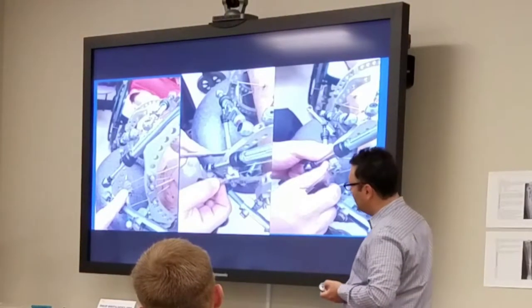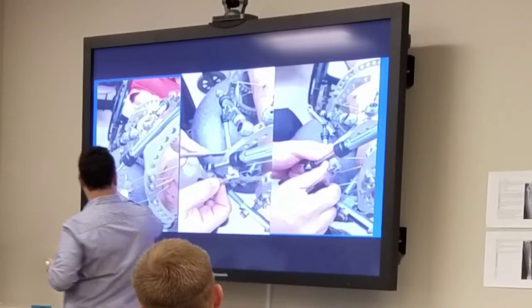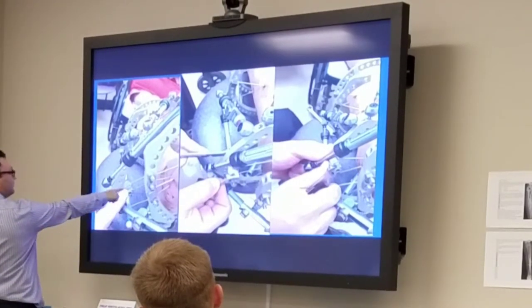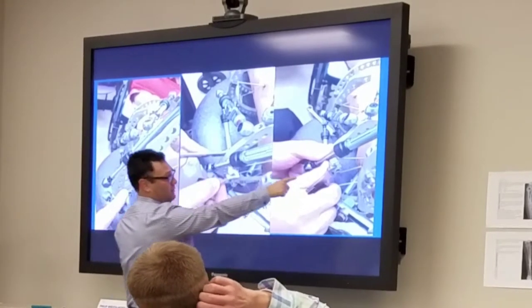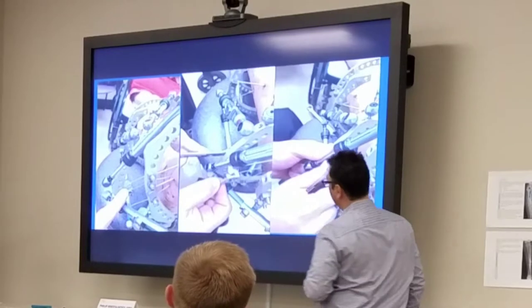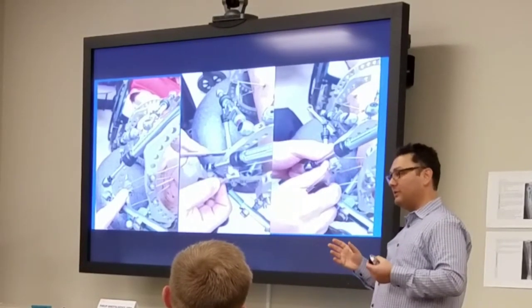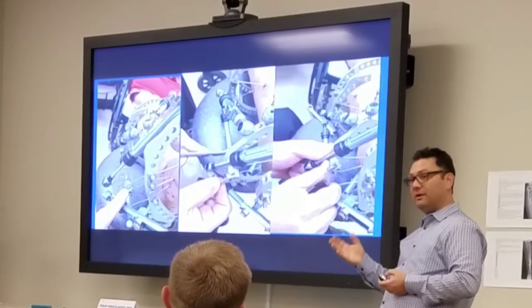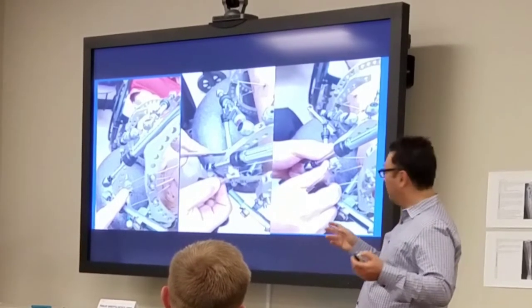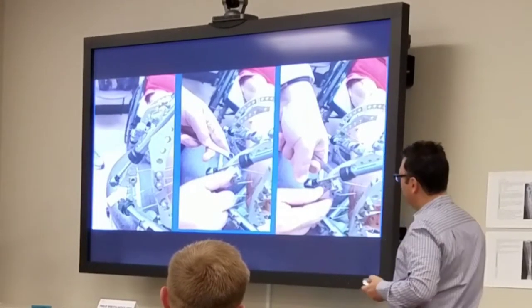So in the clinic, basically we take off the hinge, the cube, advance it, Russian technique it to retension it. So if you have to move something in the clinic, just tell the doc, hey, don't be afraid, take it off. Just Russian technique it if you don't have a tensioner. Because the tension, just make sure you leave this component still attached.